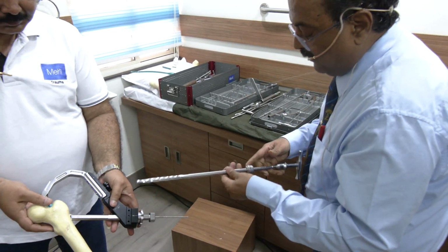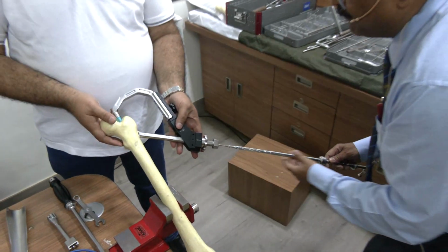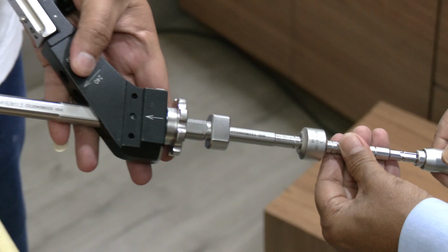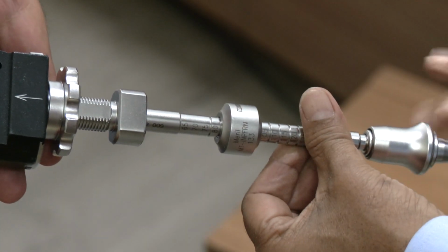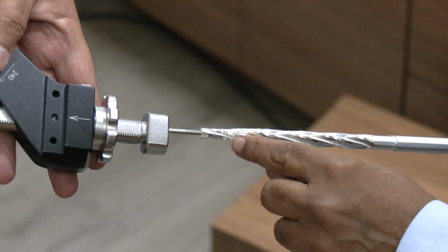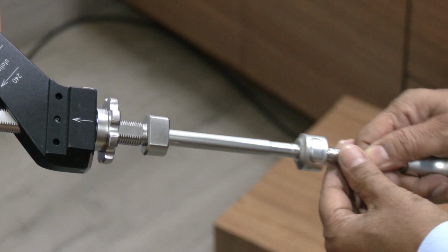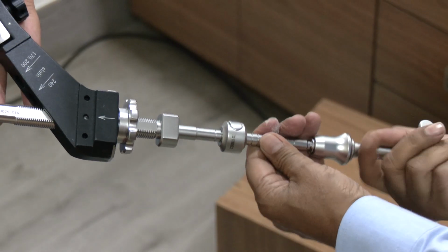Okay. Now I will lock this at 80 millimeter, and now I am using it. It's a small tip for those who understand. Normally we drill in a rotation fashion that takes out the bone, and the bone accumulates in the slots or the flutes. But here, in an osteoporotic bone, I rotate in the anti-clockwise direction.